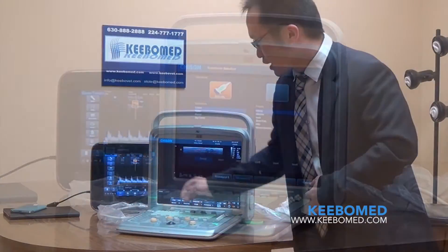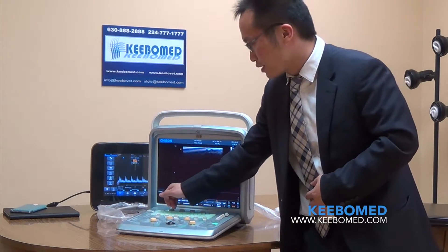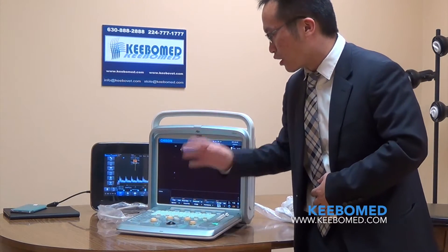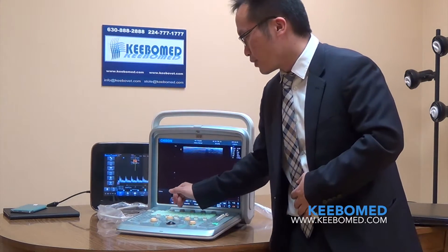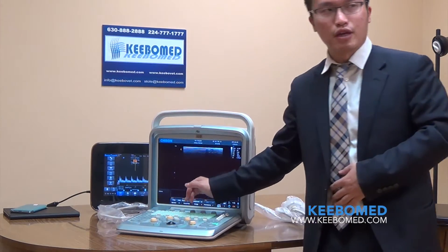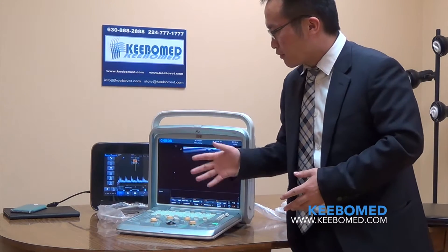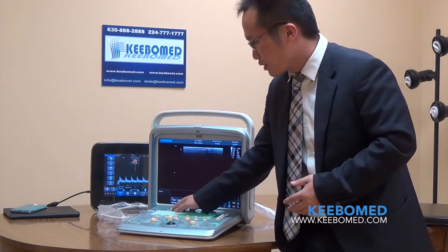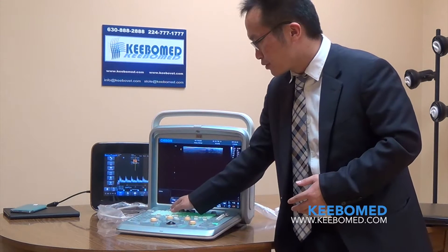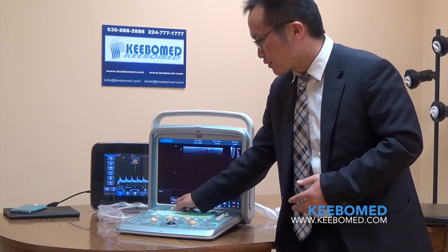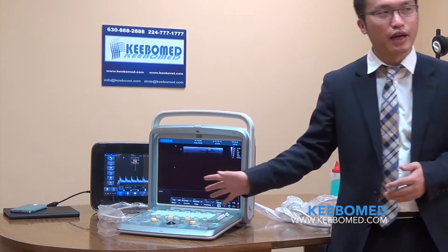The image size and the parameters are shown here. This is a small area that allows you to save some images and cine memories. For both Q5 and Q9, the system is very easy to adjust — touch it to adjust the gain, rotate it to adjust the depth.